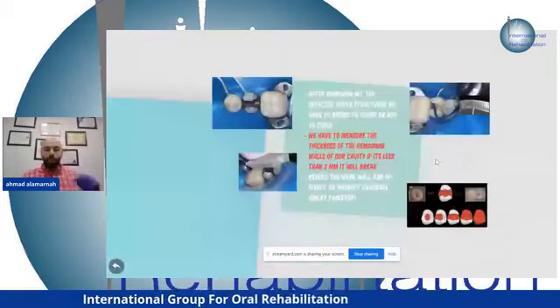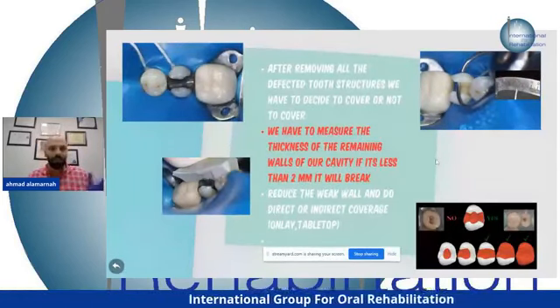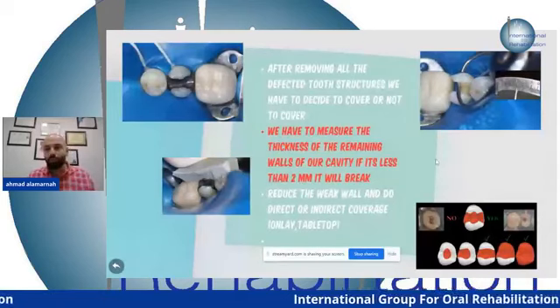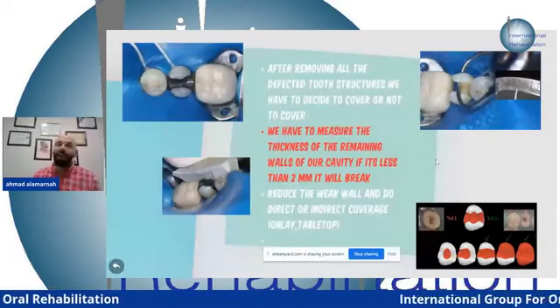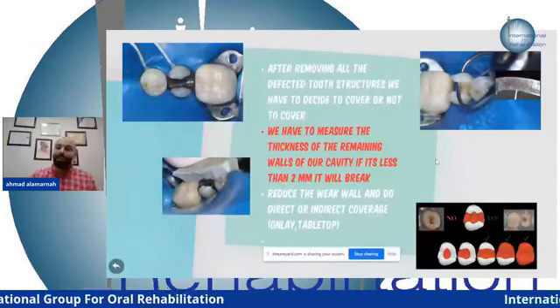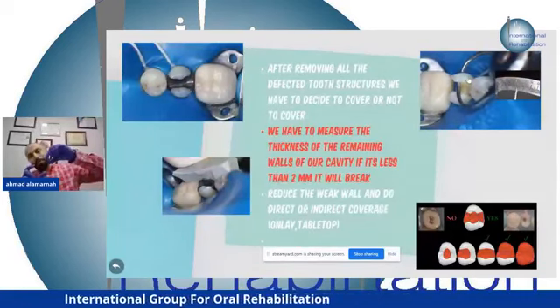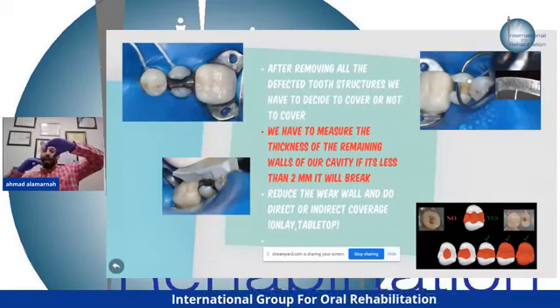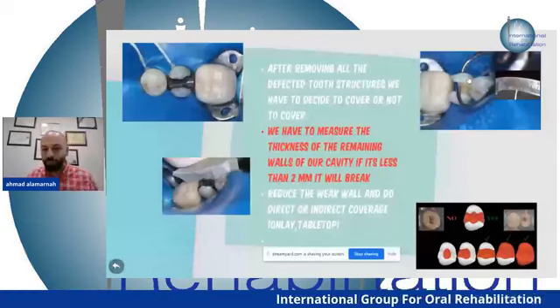Let's return here. So you have to measure the buccal and the lingual cusp, or the remaining cusp. It doesn't matter if it's buccal or lingual, mesial or distal. You have to measure it. If it's less than 2 millimeter, you have to remove it, or reduce it until you have 2 millimeter. Why? Because after the shrinkage of the composite, the stress that builds up within the composite will cause a fracture. You can see the fracture within the cervical area where it's less than 2 millimeter. Let's say it's tapering, 2 millimeter, then 1.5 millimeter, then 1 millimeter. At one of these heights, it will break, and you will have a horizontal line because of the breakage.